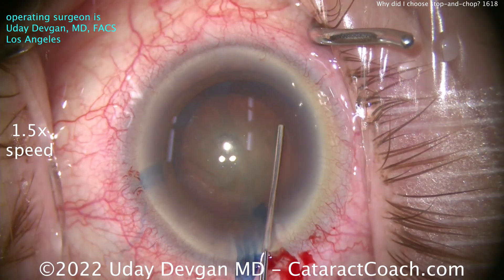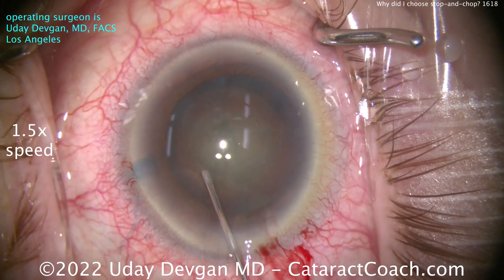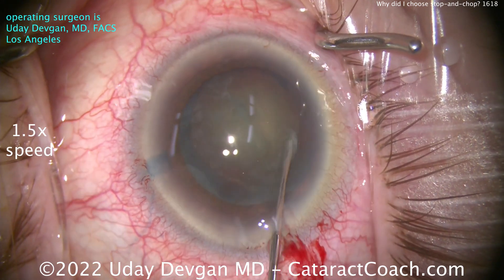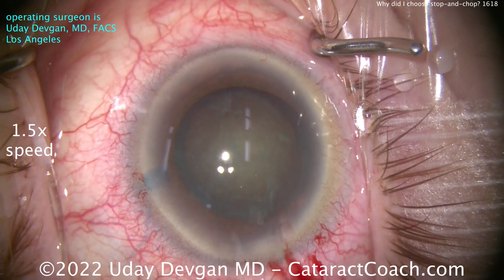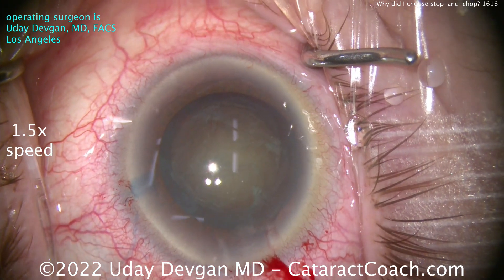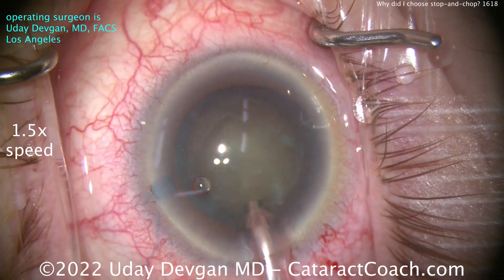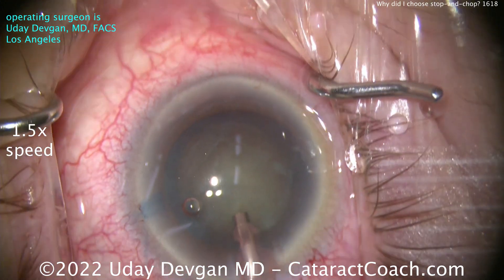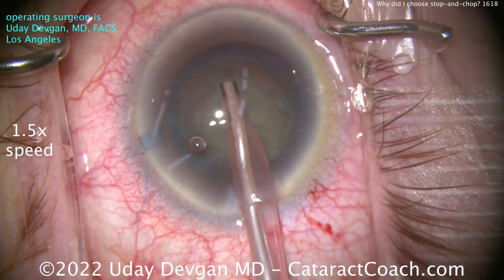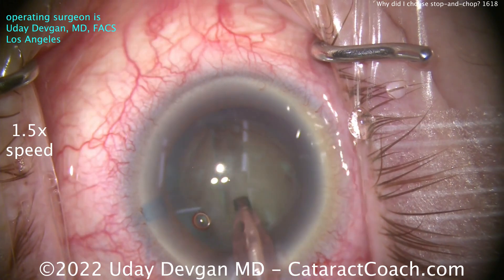Shallow anterior chamber — this is going to be a tough case. Because there's not a lot of working room, I certainly don't want to prolapse the nucleus out of the bag; the anterior chamber is too shallow. You could, in a case like this with a very shallow anterior chamber, do a little bit of a pars plana anterior vitrectomy, but why take the extra risk in a monocular patient? And with a very short axial length, you're not always sure exactly where the pars plana is. So I'm going to start off making a groove intentionally — no chop at all.